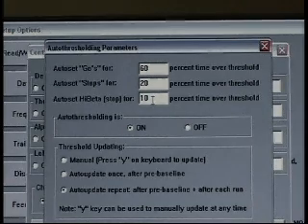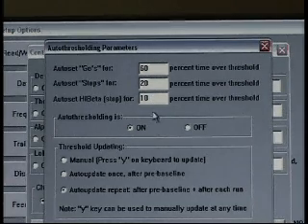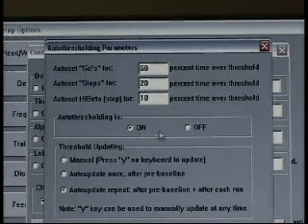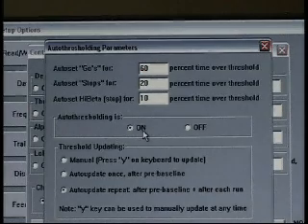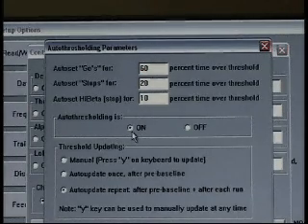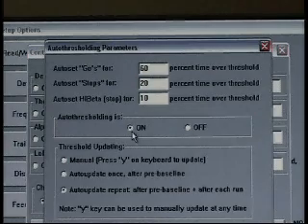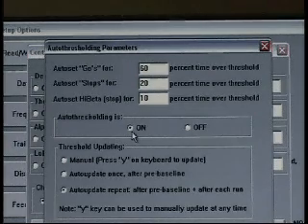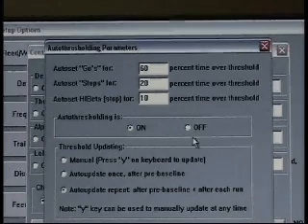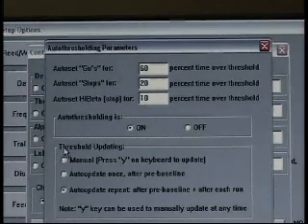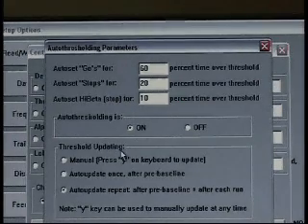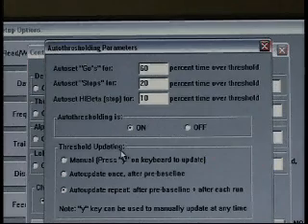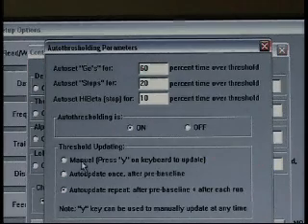Our next option is auto thresholding on or off. Pretty simple. Most of the time it's defaulted on. Most people do use auto thresholding, but for some reason if you do not want to use auto thresholding and you want to manually threshold, you can simply turn it off. As we scroll down, we have to make some decisions on how often do we want the auto thresholding to update.